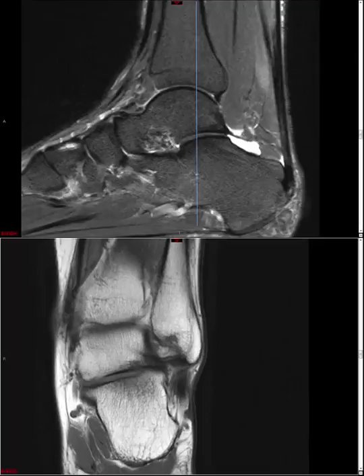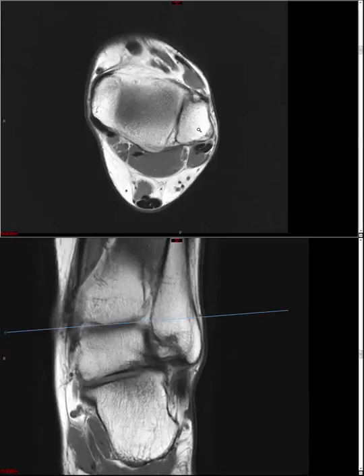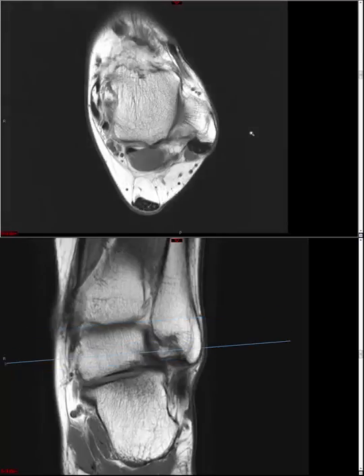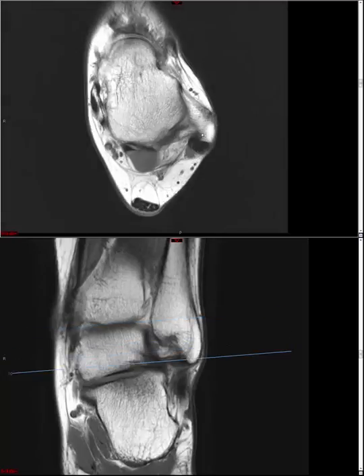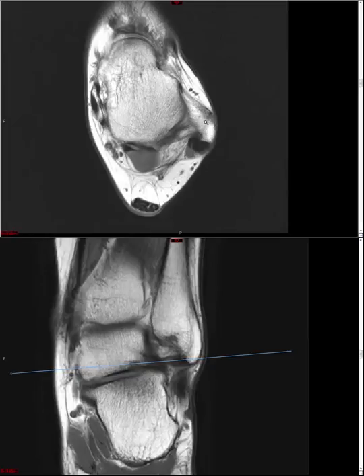To recap: at the level of the tibial plafond, we assess the syndesmotic ligaments — anterior inferior tibiofibular ligament, interosseous ligament, and posterior inferior tibiofibular ligament. If we scroll slightly more inferiorly, at the level where the lateral malleolus is concave, this is the level at which we assess the lateral ankle ligaments: the anterior talofibular ligament, the calcaneofibular ligament, and the posterior talofibular ligament.